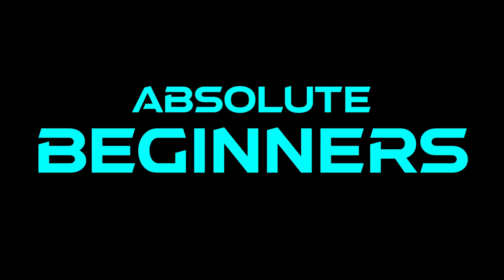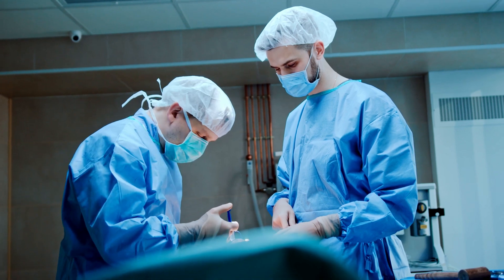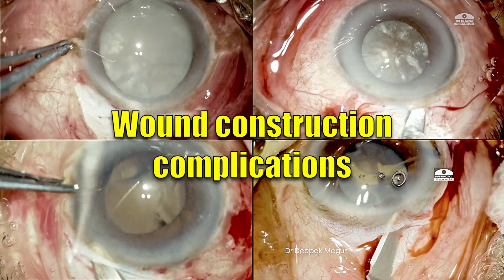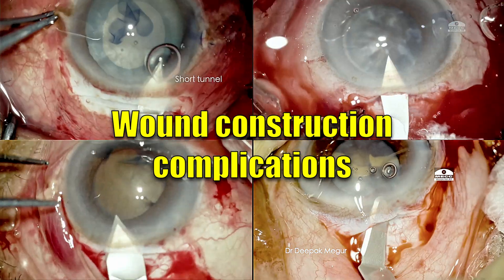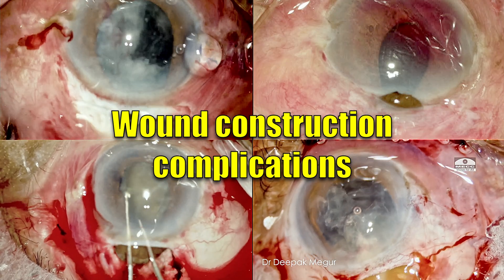This series is for the absolute beginners. Here we are going to help you understand a few concepts and suggest a few ways to practice and improve skill sets. The first few episodes are focused on wound construction, as this is the step where most beginner surgeons struggle and have lots of complications.